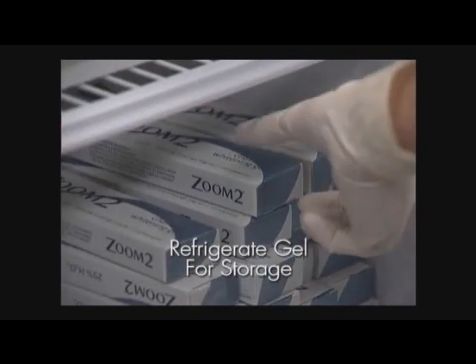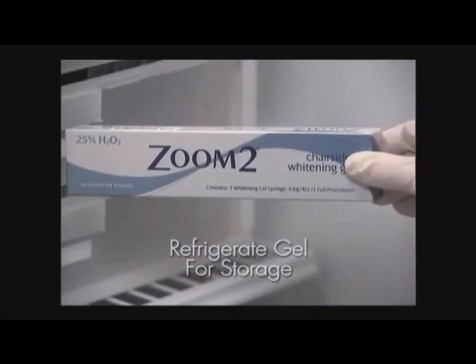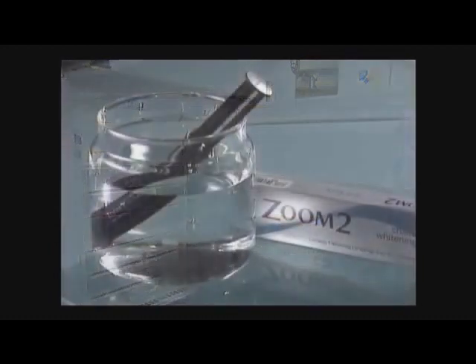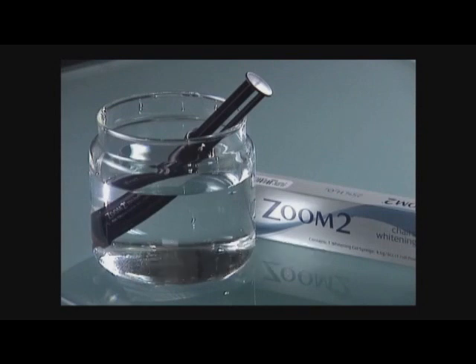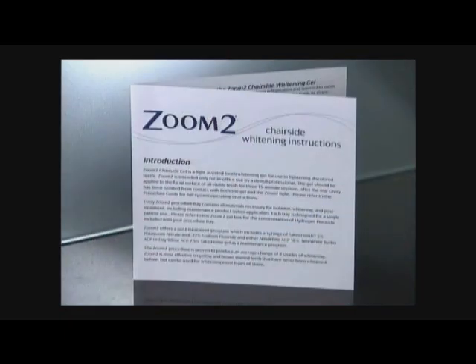To enhance shelf life of the gel, the ZOOM whitening syringes must be refrigerated while stored. However, the gel must be returned to room temperature for use. Either remove the gel from the refrigerator the night before, allowing the gel to remain at room temperature for at least 6 hours, or place the syringe in a cup of hot tap water for 10 minutes and remove the syringe 5 minutes prior to use. Refer to the instruction manual for specific temperatures.